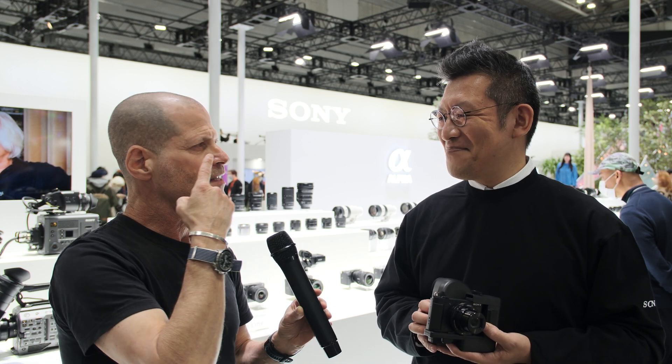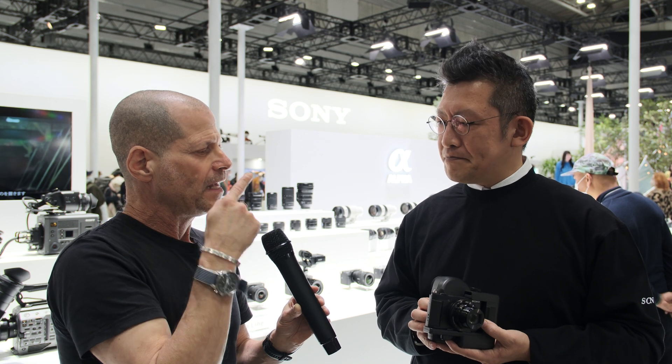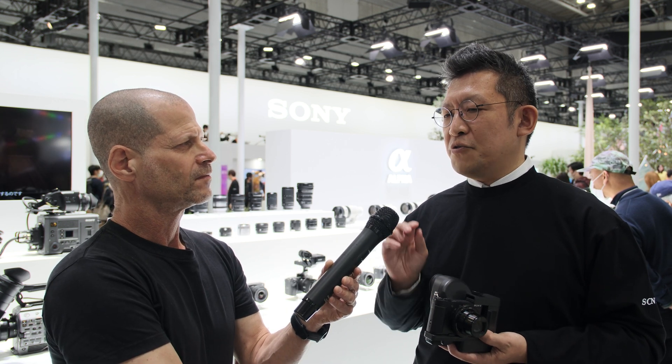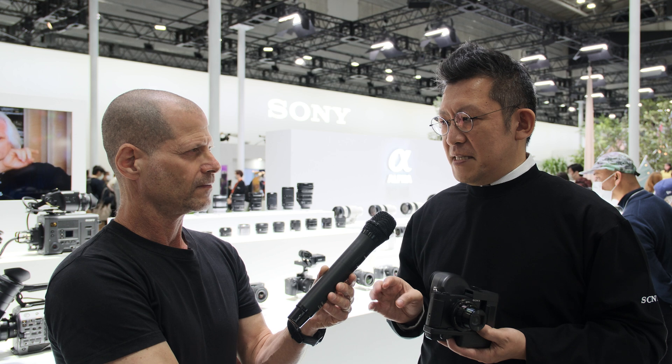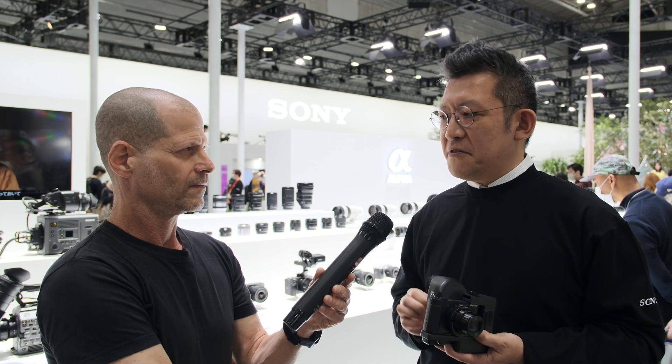Now, I have contact lenses — it's a secret, nobody knows — and I have very strong astigmatism. If I want to work with this device, do I need to keep my contact lenses or take them off? Both are okay. You can use it with your contact lenses and also without. It doesn't matter — it just skips all the focusing function of your eye.